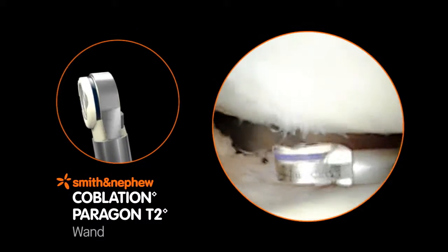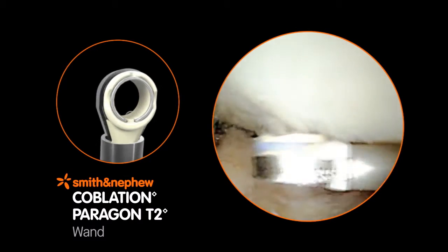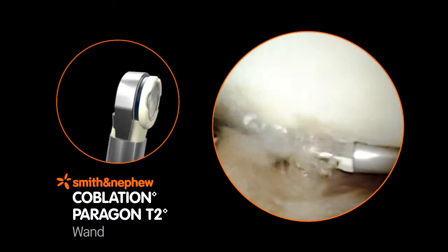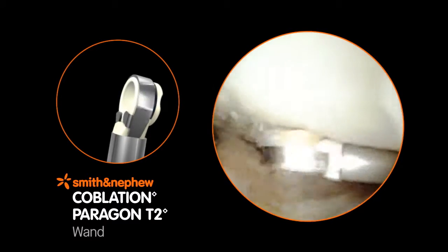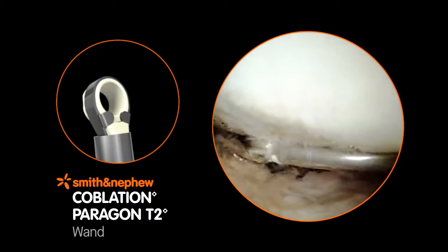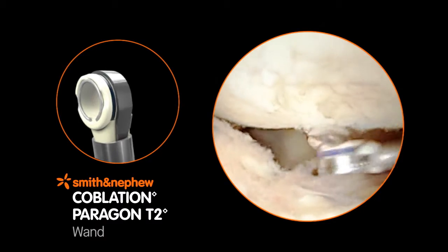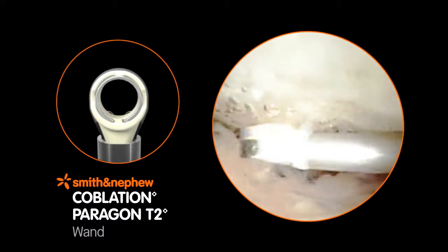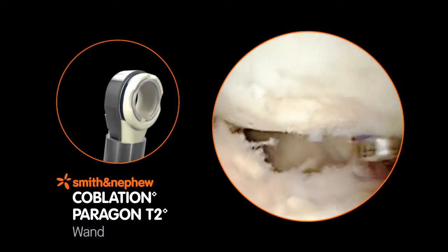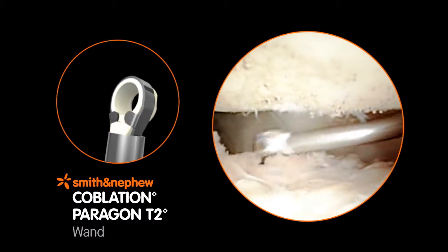The Paragon T2 Coblation Wand is specifically designed to offer focused removal of soft tissue. Its geometry is well suited for the contours of the femoral condyle, tibial plateau, and patella. The Paragon T2 Wand also provides a visual indicator of local temperature with T2 technology, which changes color from blue to white when the temperature exceeds 50 degrees Celsius, plus or minus 5 degrees Celsius.